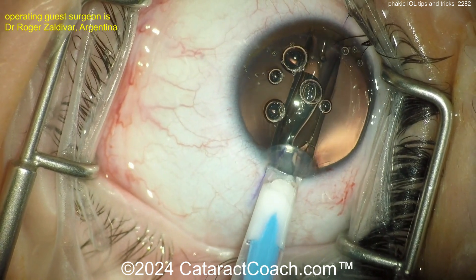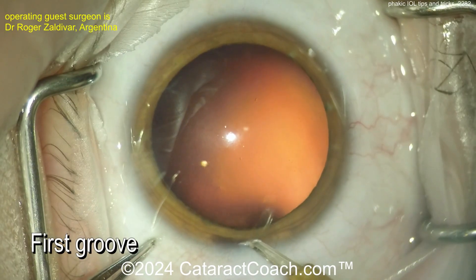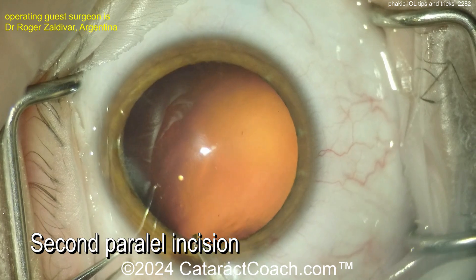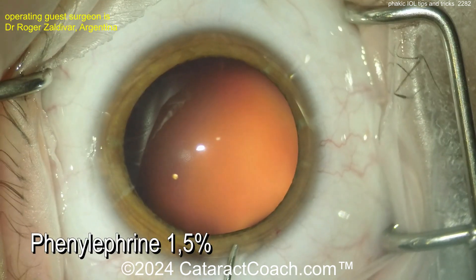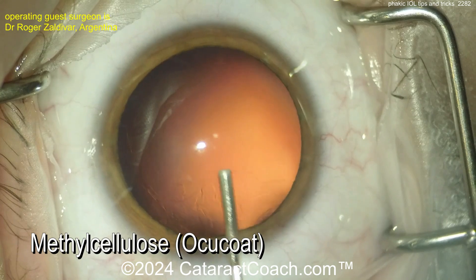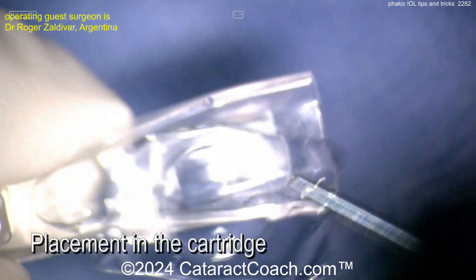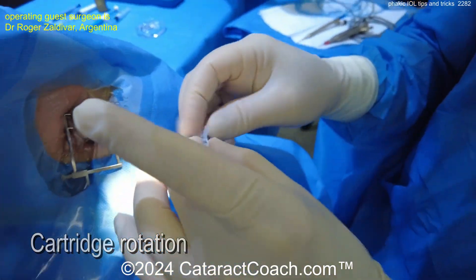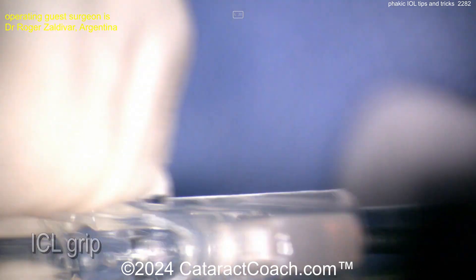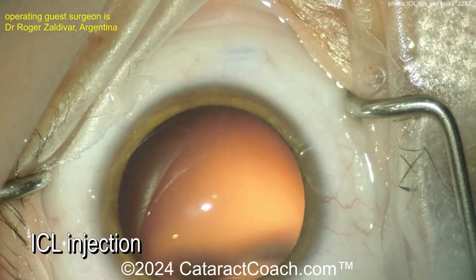Here's a routine implantation. You can see this is an interesting technique as the ICL goes into the eye. Just kind of tapping on the cornea helps it unfold. Here's a complete routine case — making a main incision, some lidocaine going inside as well, there's the phenylephrine, also a paracentesis next to it. HPMC, hydroxypropyl methylcellulose, is being used as the viscoelastic. Here comes loading of the lens — you can see the lens being placed inside the cartridge. These are very thin lenses made of a collagen-polymer type material, and then you grab with forceps through the tip. These specialized forceps grab that ICL and bring it in to the tip. There's the microsponge hydration and now you get this thing delivered nice and easy into the eye.